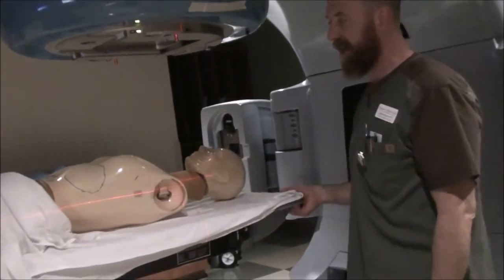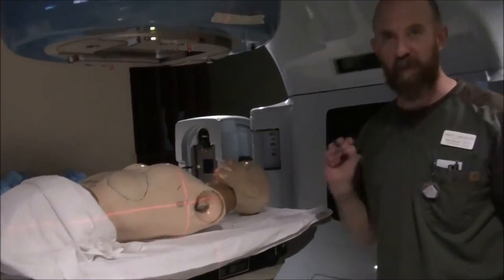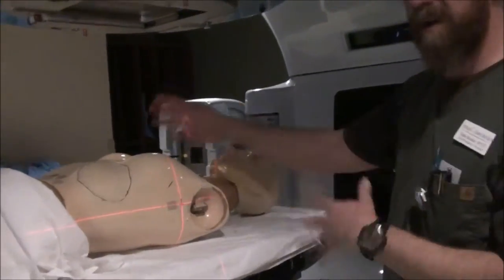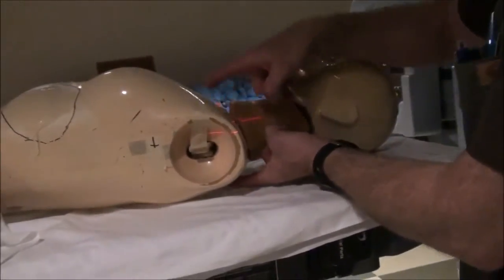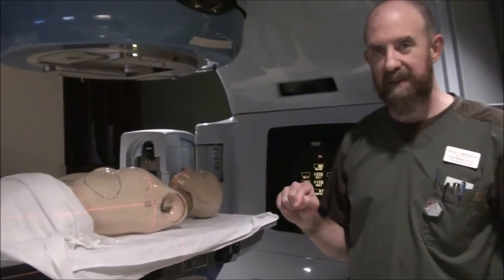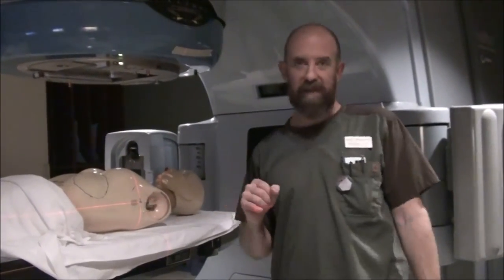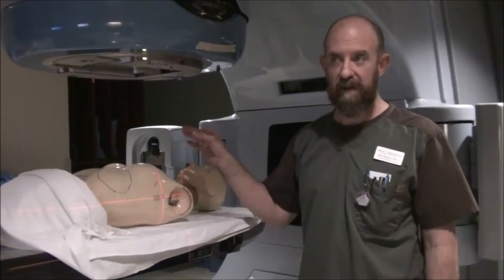Get your caliper in. One important thing I forgot — before you move your patient, give yourself a three-point setup so you can reproduce your patient's position. Very important. Now we've got all our marks on our patient, a three-point setup, and SSDs at all our dose points. Get your caliper in and take separations at each dose point location, so you'll have four SSDs and four separations. You do your calipers last because you're likely to move your patient getting the caliper underneath them four times. We did take one separation early on to get our midplane, and that's fine — you may need to redo some of the fluoro if that happened.